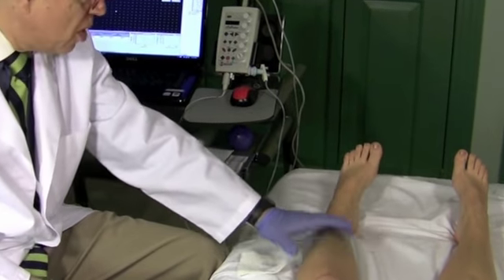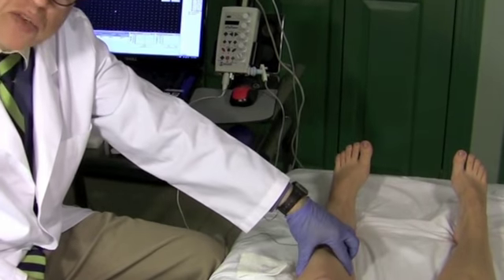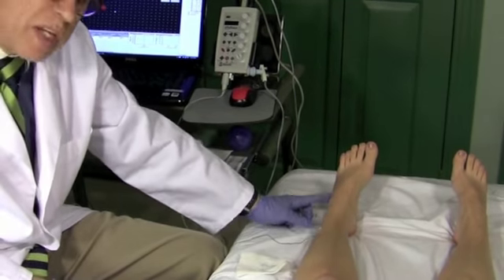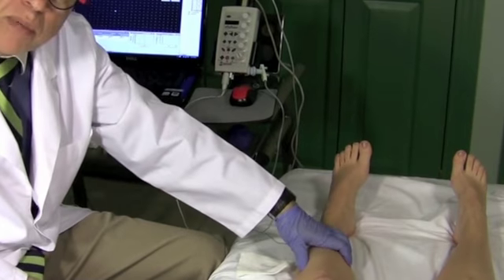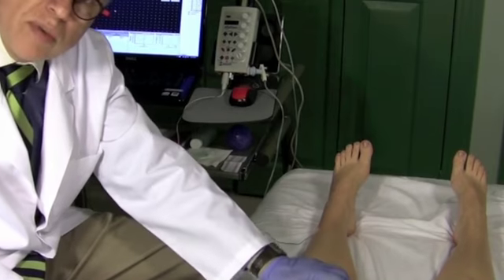However, if you have this involved, the EDB involved, and the medial gastrocnemius muscle involved, it's more likely than not a root lesion. That means because this one has S1 and this one has S1, it's more likely than not to be an S1 root lesion than a peroneal and tibial muscle problem, which is sciatic, but it's less likely. But this is how we troubleshoot that.